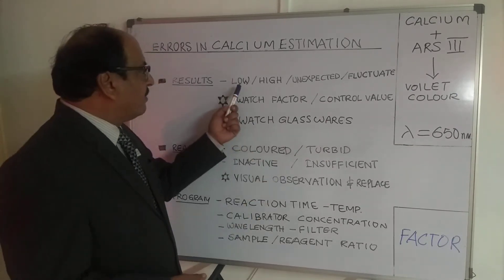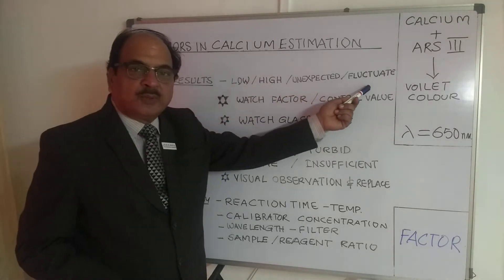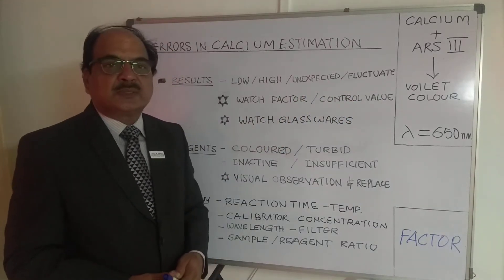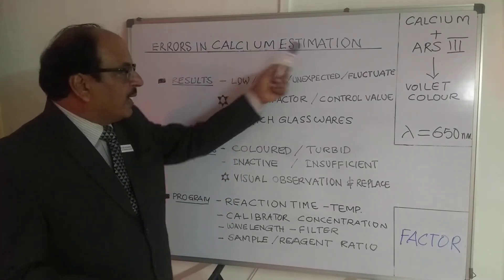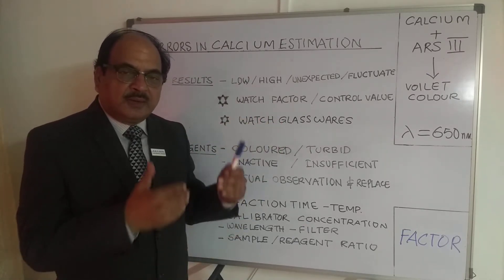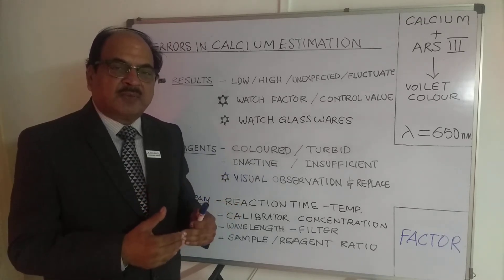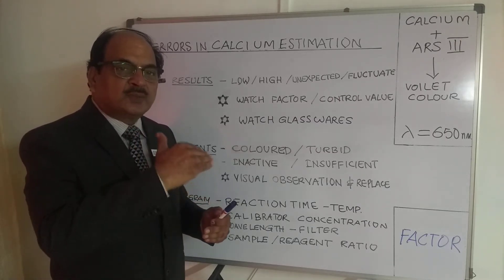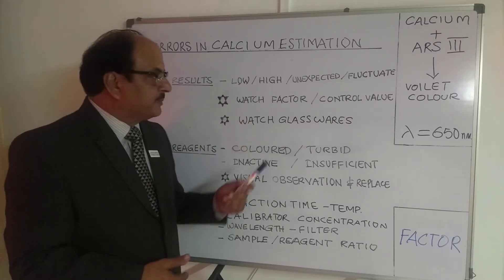In result-oriented errors, there are three or four categories: you can have low results, high results, fluctuating results where results are sometimes high and sometimes low, and sometimes results that are not as per the clinician's expectation. The important thing to watch in order to eliminate these errors is the factor. The factor is the calibrator concentration or standard concentration divided by the optical density when you run the assay.